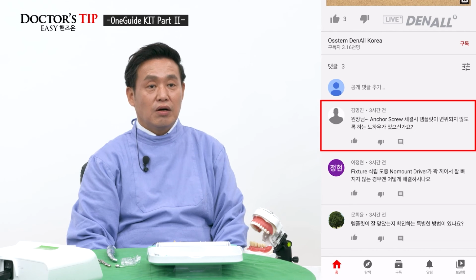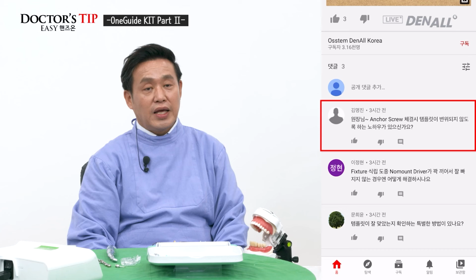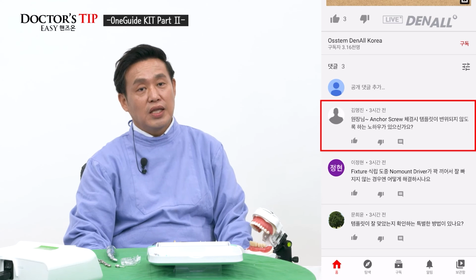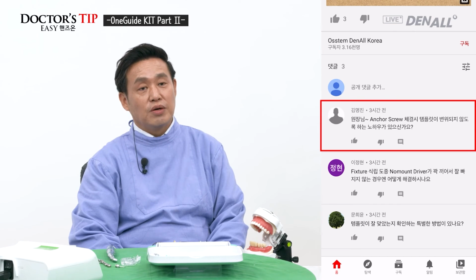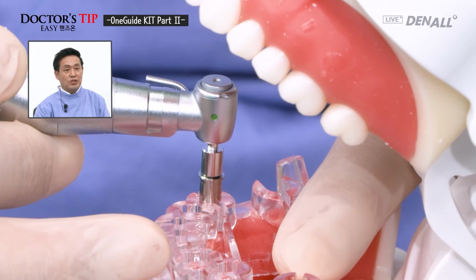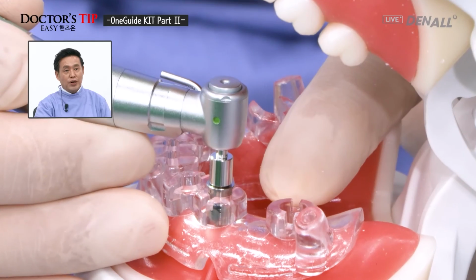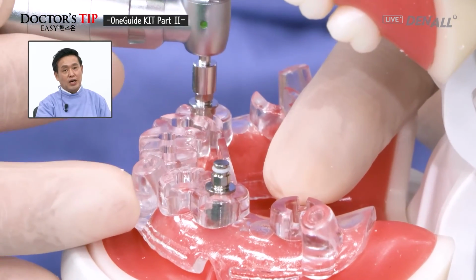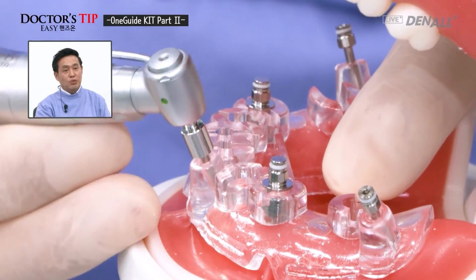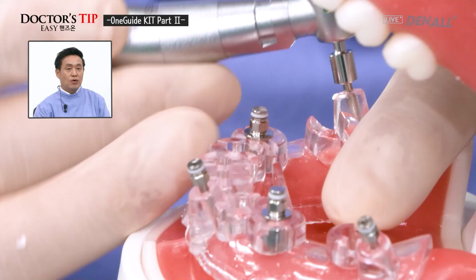Another point, when you connect, as I've showed you, the reason why we do vertical anchor first is because if you connect a lateral anchor, labial or lingual connection, they can be deviated. So that gingiva is not pressed too hard, check both sides and then connect the vertical anchor first. So vertical anchor is not fully connected. It's connected 80% and check position and connected fully. And if there is lateral anchor, there are 3 points. Do them in turn so that the template is not deviated.